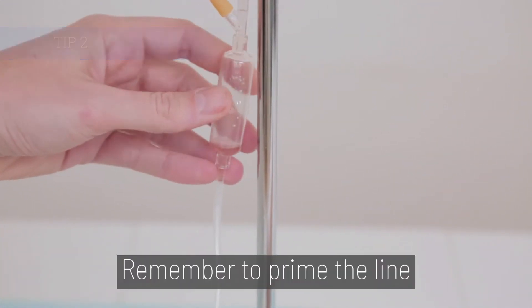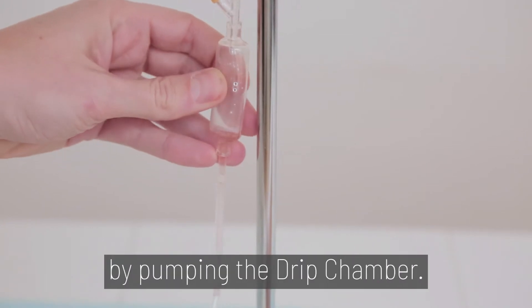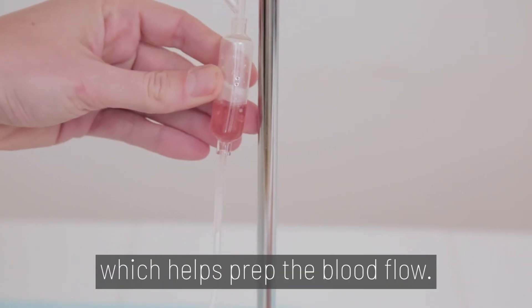Tip 2. Remember to prime the line by pumping the drip chamber. Fill the chamber about halfway, which helps prep the blood flow.